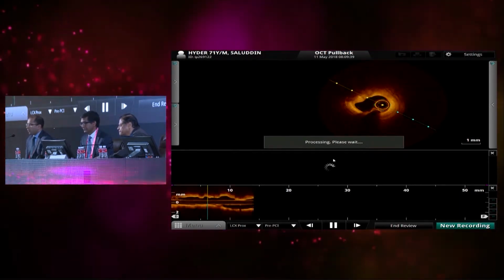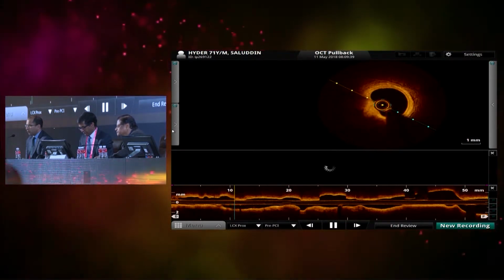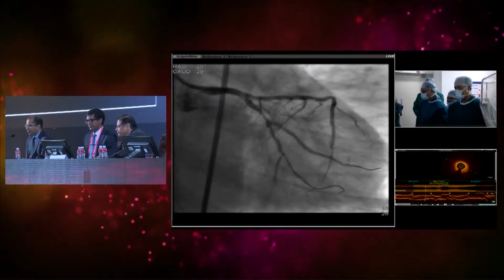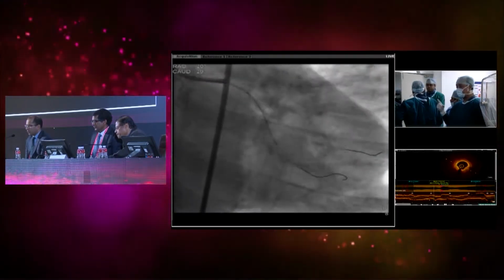This is the pre OCT picture what you are seeing. Can you hear me? Okay. I'll ask Dr. Akash to give a comment on the OCT picture.